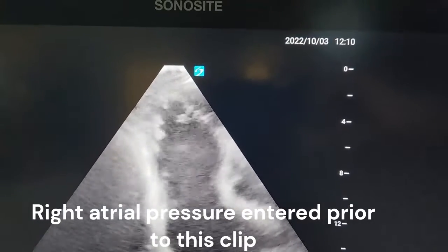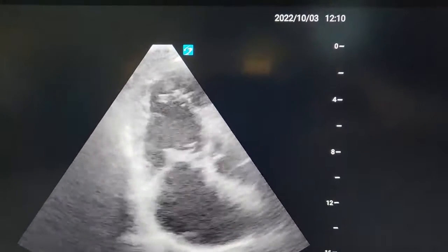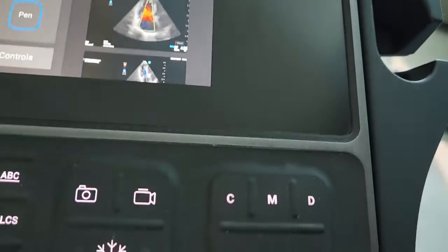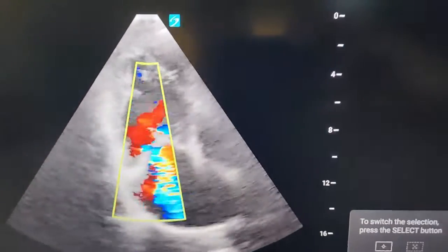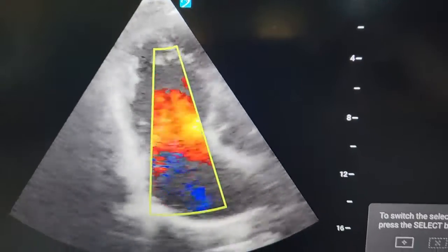RV focus view, tricuspid valve. First thing we'll do is hit color, and we want to get the largest TR jet we can.